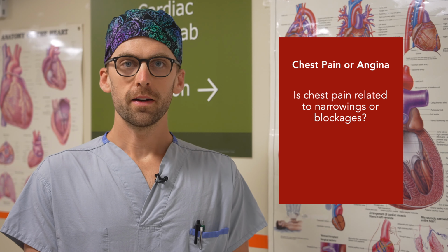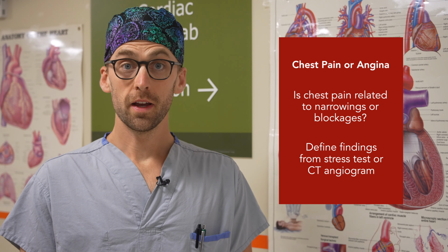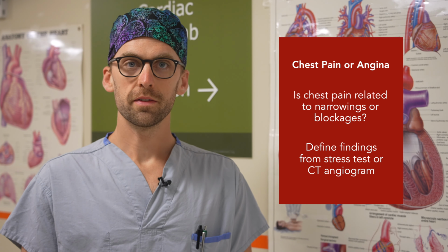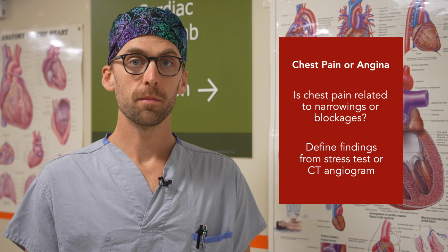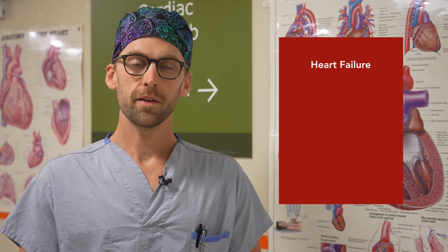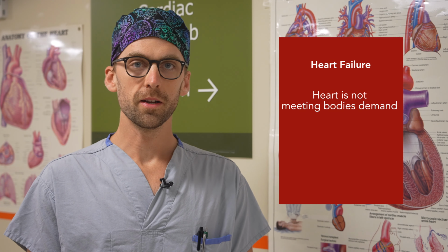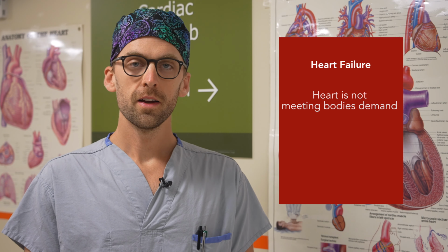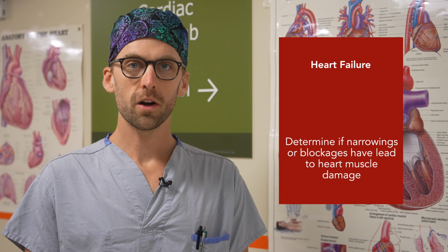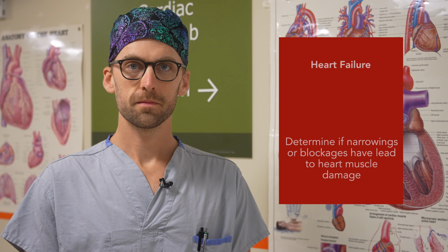You may already have had other procedures leading up to this test, such as a stress test or a CT angiogram. The angiogram will for certain show whether you do have narrowings or blockages, as well as how significant they are. This will provide your doctor the most accurate information needed to best manage your care. Heart failure. This occurs when the heart is not pumping well enough to meet the demands of the body.